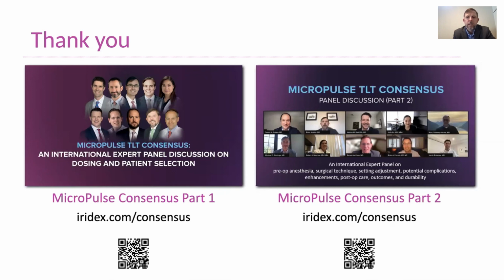And I would second Jacob that this is a great alternative for some of our patients who have that moderate disease and don't tolerate drops, but you don't really want to take them to that next step of incisional surgery. This can give them a very good option of decreasing their drop burden without going through major glaucoma surgery.